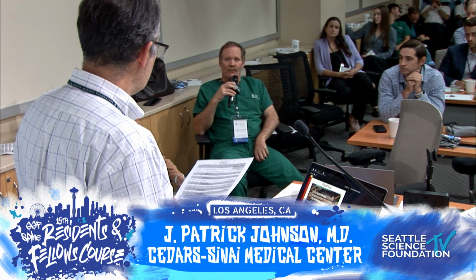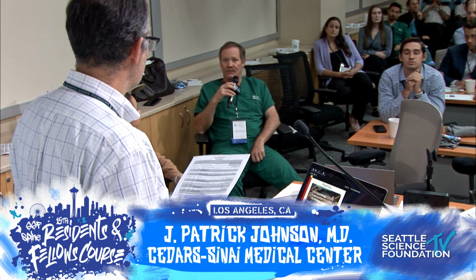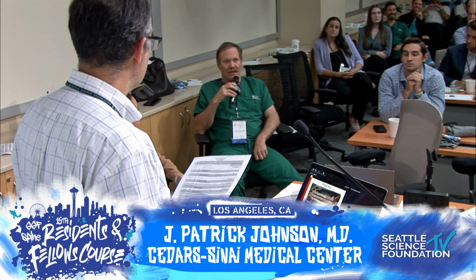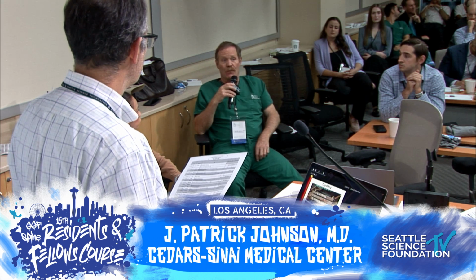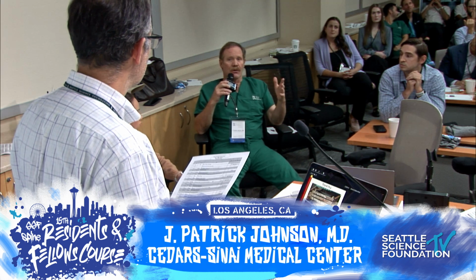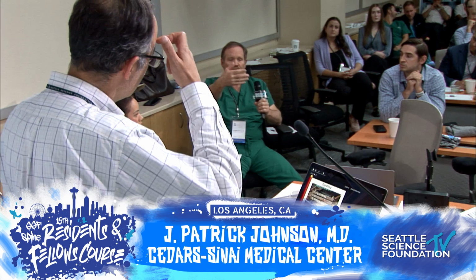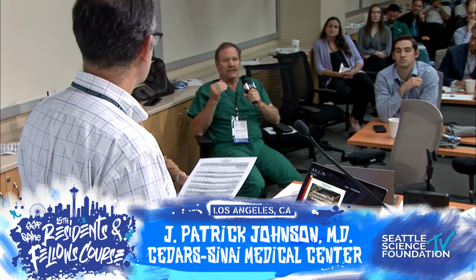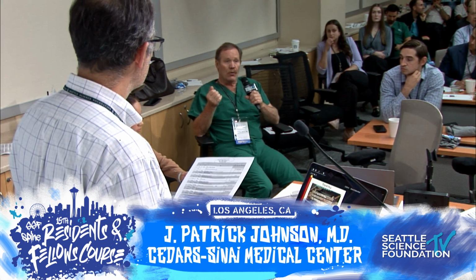I've tried to convert all of my practice into artificial discs, and it's about 50%. And I do 2, 3, 4 level cases with frequency. We battle to get them approved, but cases that I think need them the most are like that one guy that you showed with the bone-on-bone discs. And we spend a lot of time loosening up the uncovertebral joints. I'll take a curette around next to the vertebral artery and loosen those up. It's restoring motion, because if you just put an arthroplasty into a partially arthrodesed segment, it will go on to arthrodese.